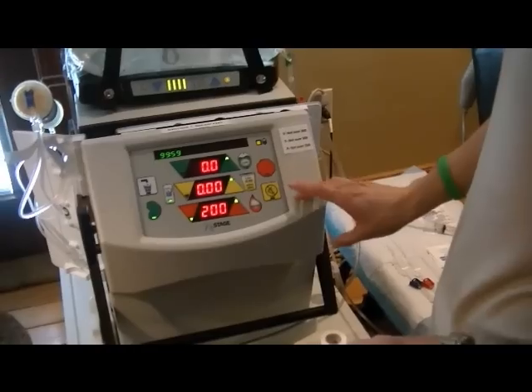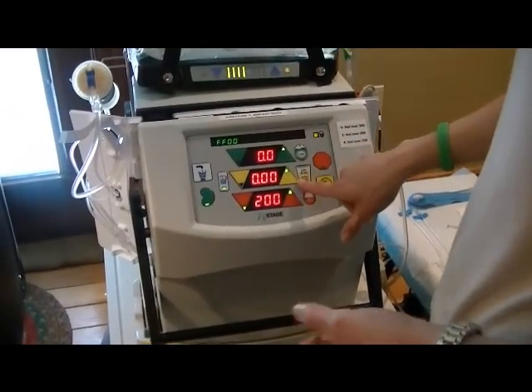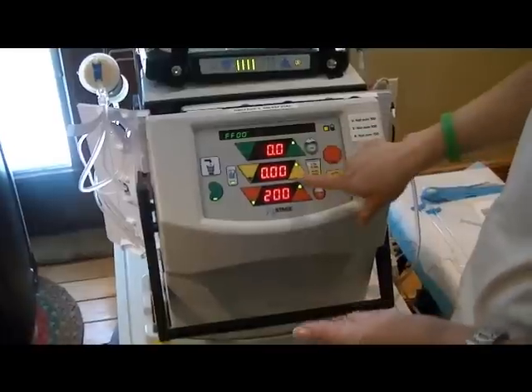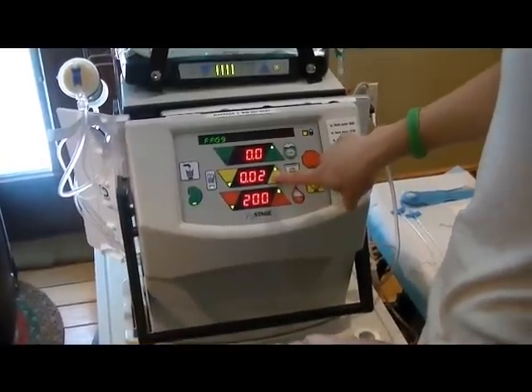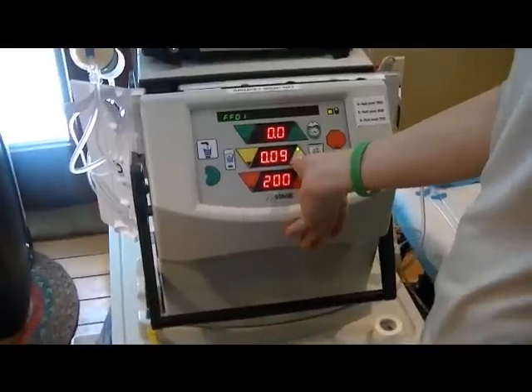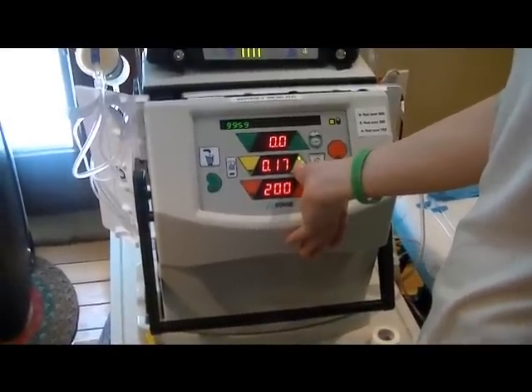We can set the machine now too. You always add 0.3 because that's how much he gets in the rinse back. So we'll set the machine here. This is the volume screen and a rate screen, and you set it to what you want it to be.